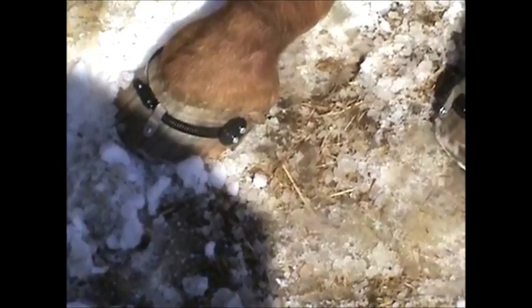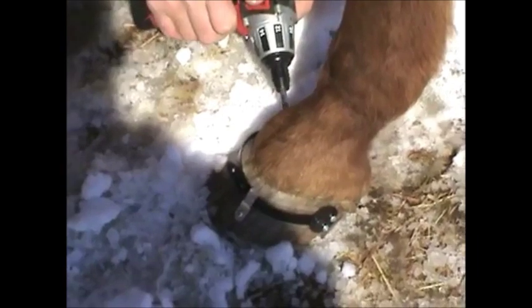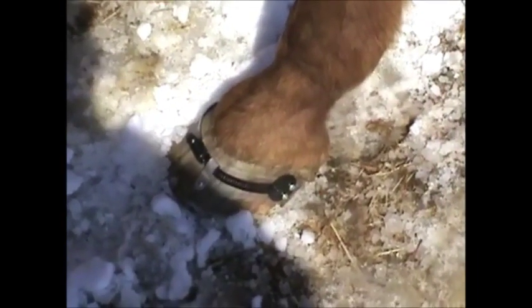Two more screws and we'll be done. I wish I would have videoed that miniature that I did — that I just came from.